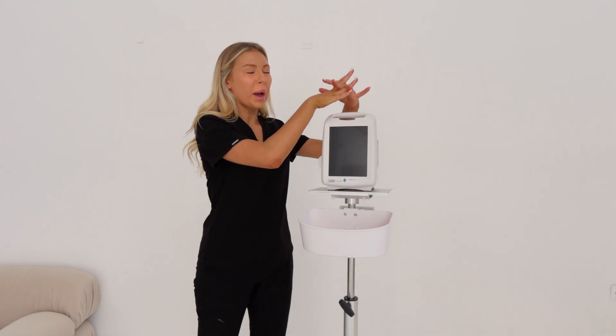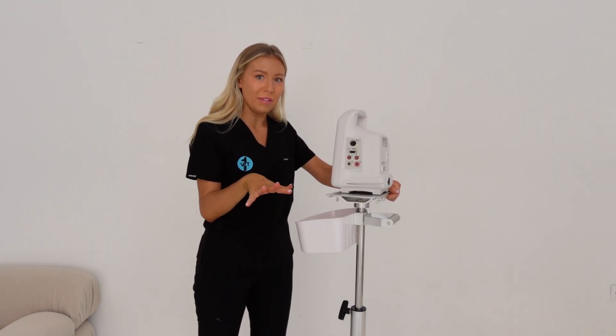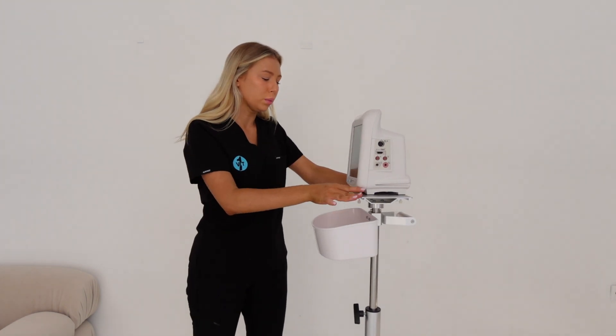The first monitor I'm going to look at is part of the touch series - this is an Iris Touch 400. It comes with sensors and probes for ECG, blood pressure, temperature, and SpO2. The only one it doesn't come with is capnograph, so end-tidal CO2, but lots of clinics do opt in to have that added because it is a really good tool.